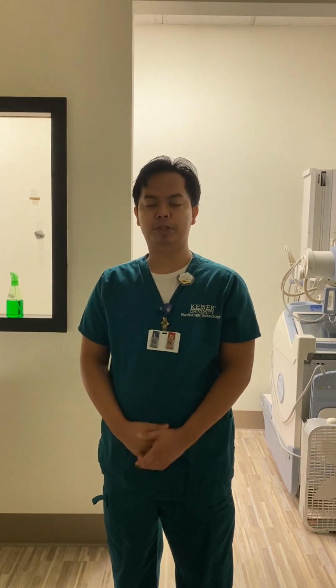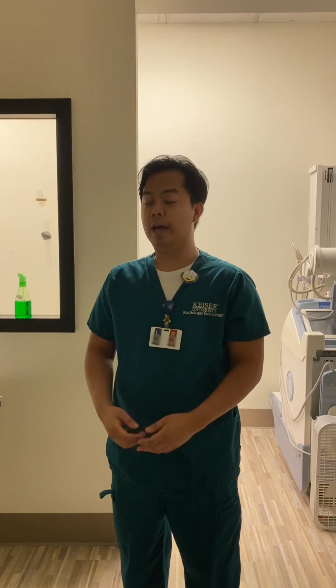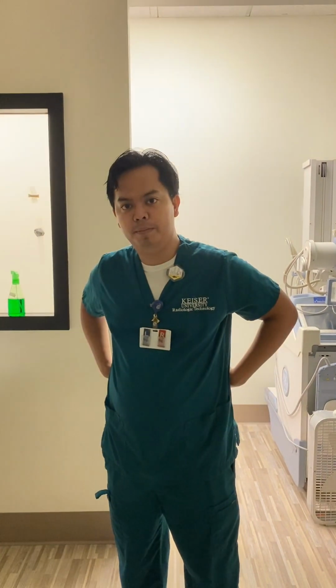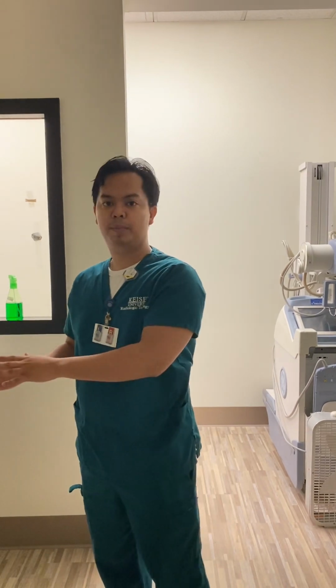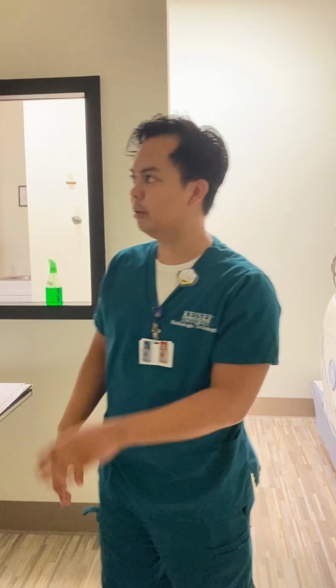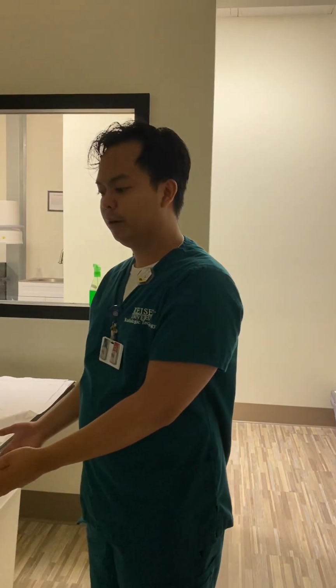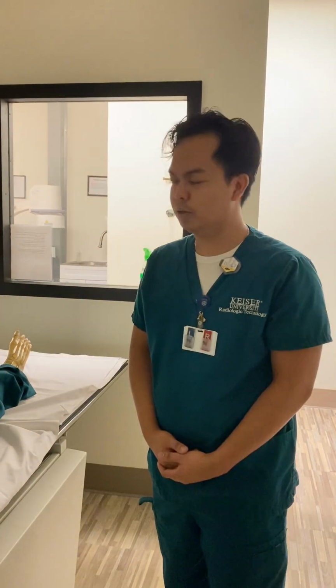Once you have them changed, have the gown open in the back, and you'll be prepping the room while you wait for them to change, making any adjustments. Then I'll have the patient lie down here, facing towards the ceiling, since this is supine.